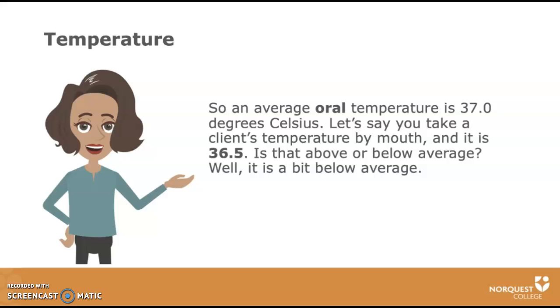So, an average oral temperature is 37 degrees Celsius. Let's say you take a client's temperature by mouth, and it is 36.5. Is that above or below average? Well, it's a bit below average. Is it something you need to report, or is it within the normal range?